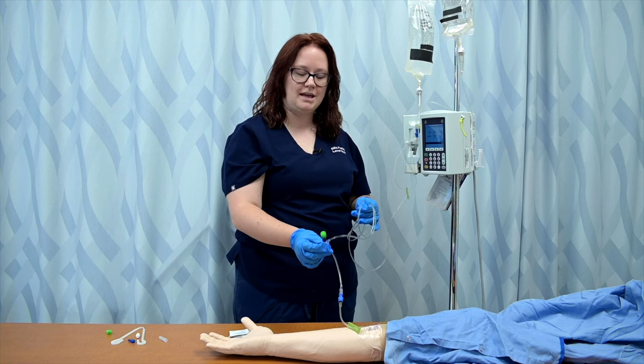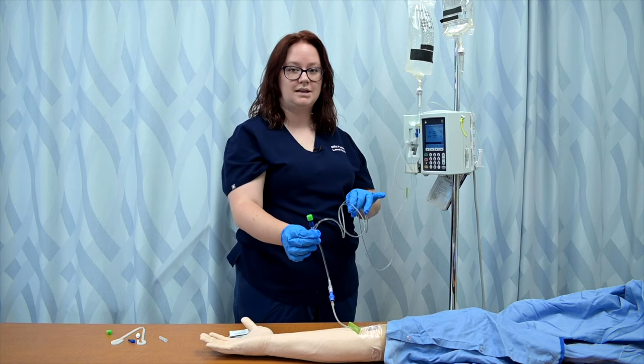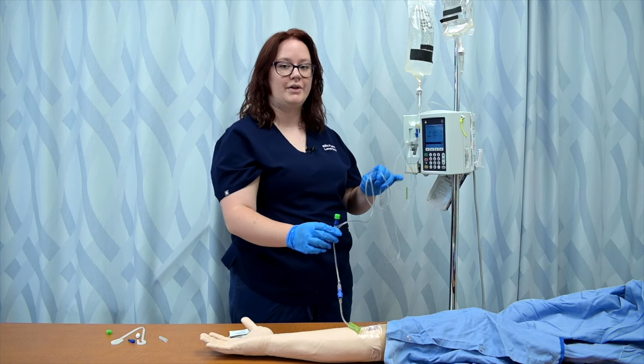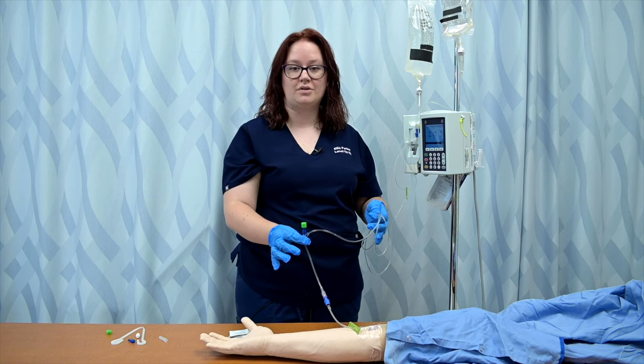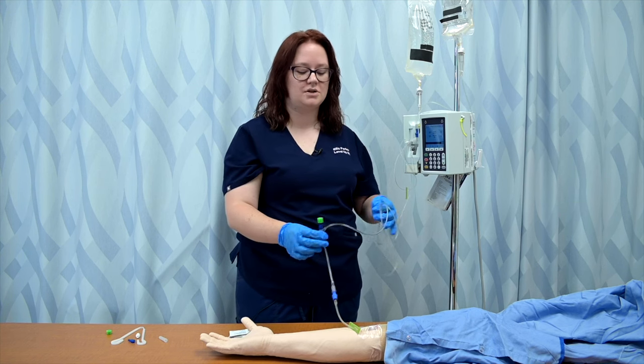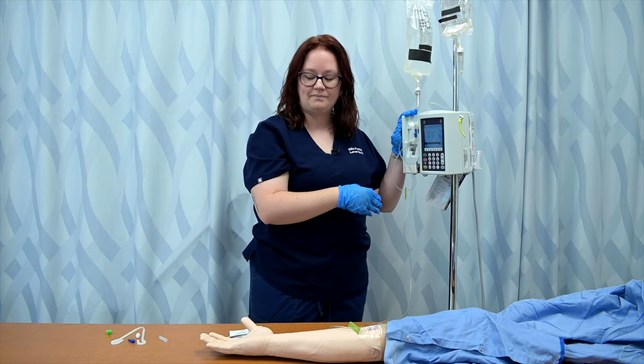I've seen many students attach their secondary line to this port because it's accessible, it's right in sight, and we use it for other things. But unfortunately, if you attach your secondary medication to this port and then open the clamp, it administers itself via gravity and you have no control over the rate at which it's being administered. So you want to make sure that it is in fact going through the pump itself.